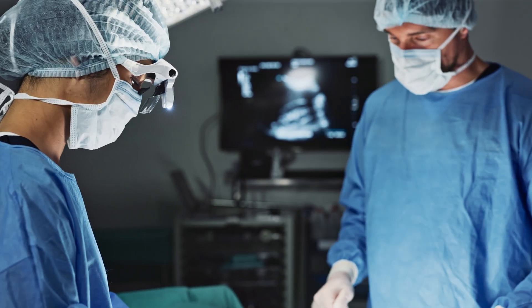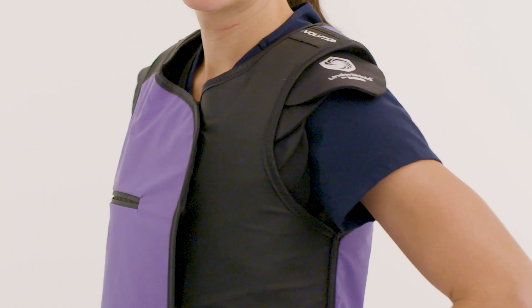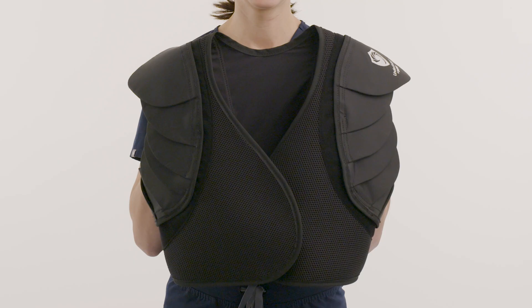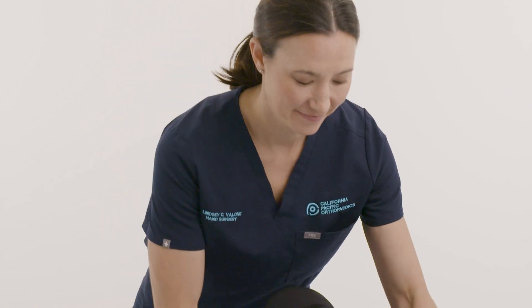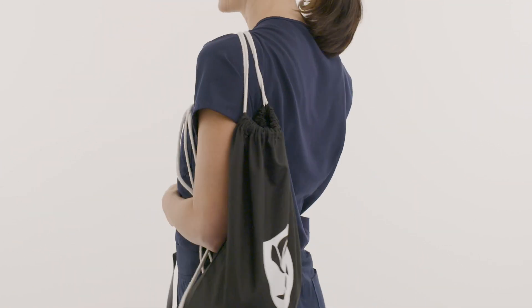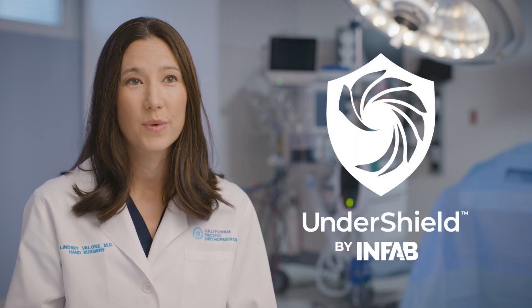This accessory would also protect men in addition to women. We come in all shapes and sizes, so when we're thinking about aprons and vests they may fit each individual differently. The Under Shield is less than one pound and it can easily be folded into a bag and you can take it between hospitals. I love that this is a customizable, adjustable option that's an accessory but will always provide adequate protection for the person who's wearing it.